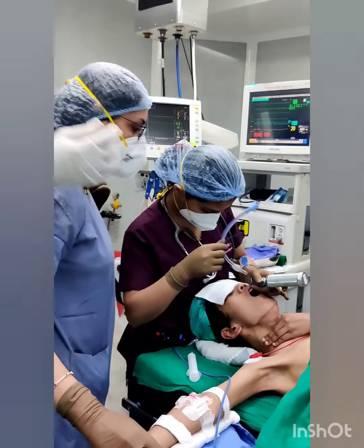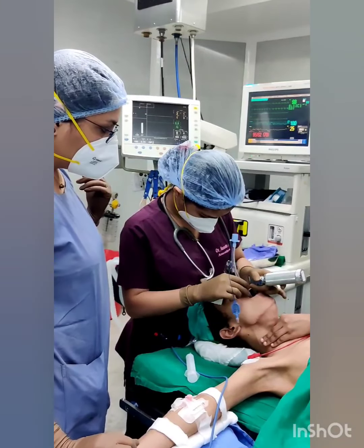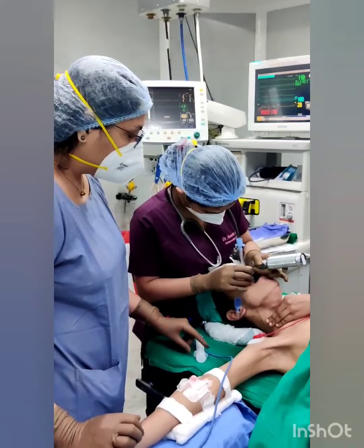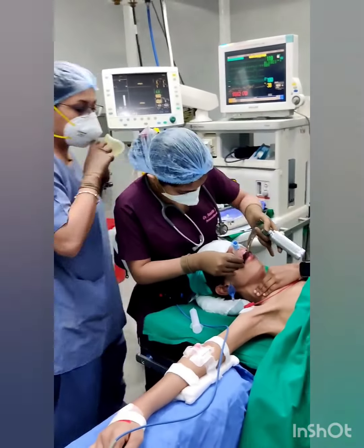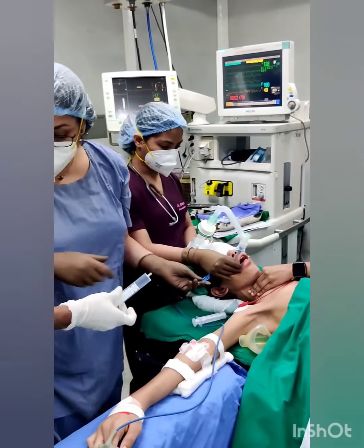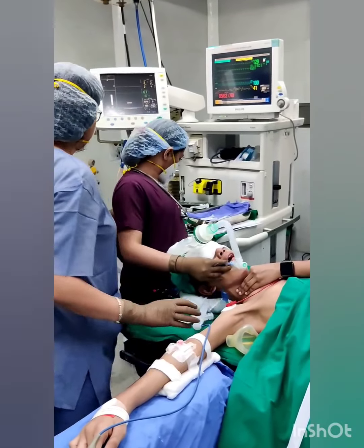Preferably, an experienced intubator should do the rapid sequence intubation and minimize the duration of laryngoscopy and intubation. Maintain the cricoid pressure all throughout the intubation. Once the endotracheal tube is placed into the trachea under direct vision, attach the ventilating circuit or the Ambu bag and gently ventilate with 100% oxygen. Inflate the endotracheal tube cuff optimally till no leak is heard.